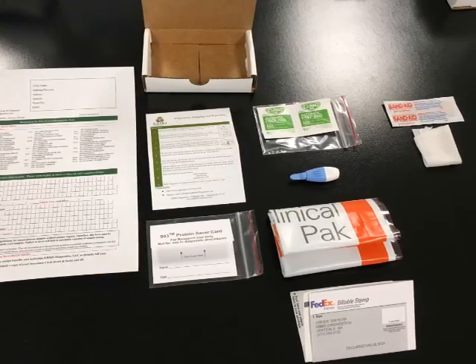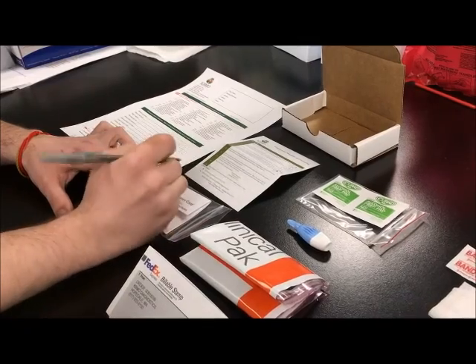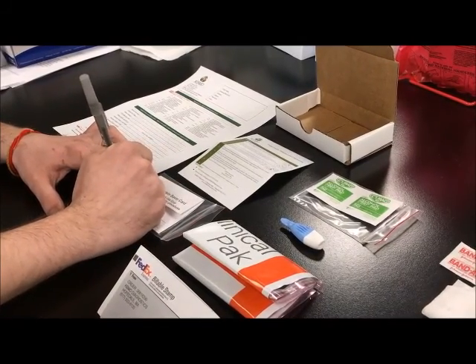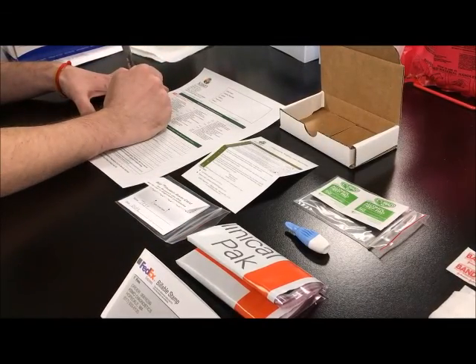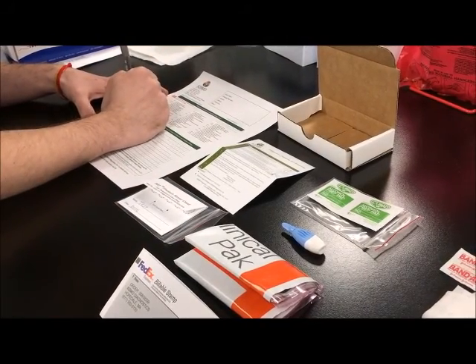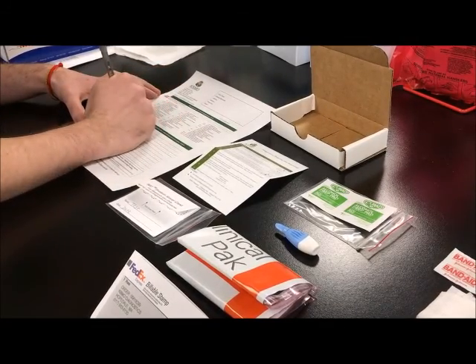In addition to these items you will also need a piece of gauze and a band-aid. Write your name and collection date on the protein saver card, and fill out the requisition completely including the collection date, physician signature, first and last name of the patient, and date of birth.